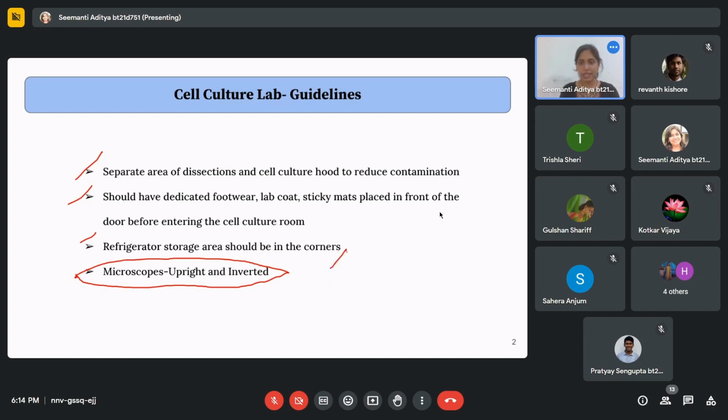It can be star-shaped morphology like this, or it can be an elongated shape like this, or neuronal cells can be very fibrous in nature, like this. So depending upon whatever cells you're working on, your morphology is going to be different, and by looking at the cell morphology, we can figure out whether the cells are healthy or not.